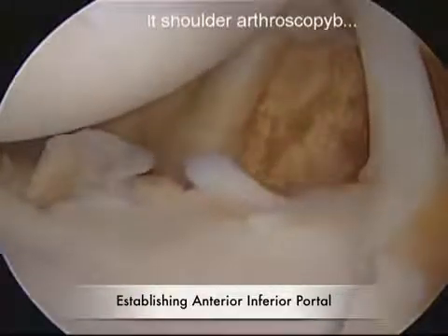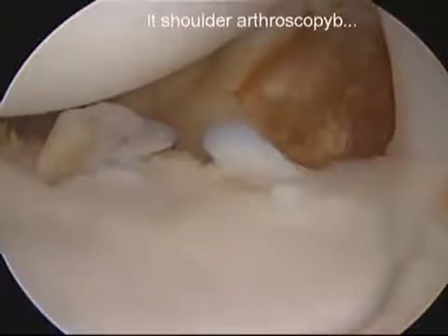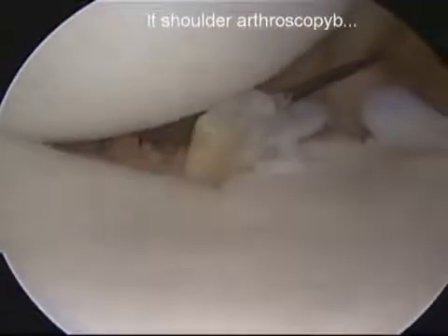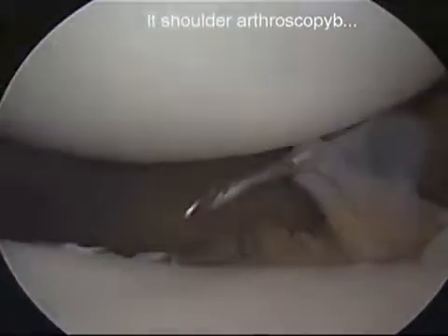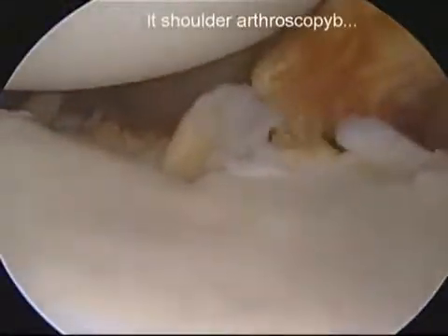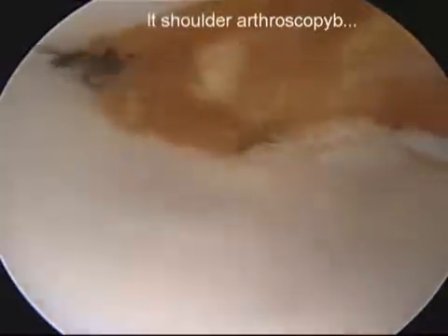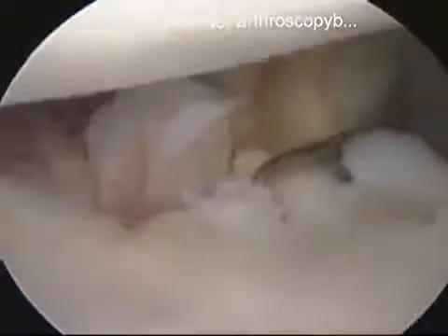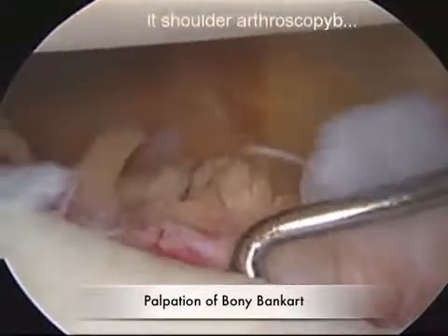The anterior-inferior portal is established utilizing an inside-out technique by palpating the superior edge of the subscapularis and utilizing a spinal needle to ensure adequate access to the inferior aspect of the glenoid. This is followed by a standard metal cannula, which is subsequently dilated up to an 8 mm cannula. Once the cannula is inserted, a probe is used to palpate the bony Bankart to help judge the size and mobility of the bony fragment.